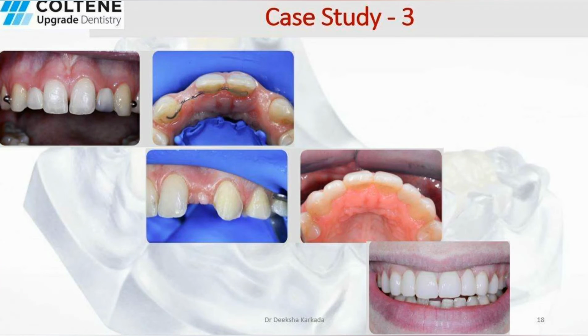This is another case where missing lateral incisors were replaced with an over-contoured partial denture. So minimal buccal preparations were performed for occlusal reasons, and all the front teeth were veneered with BRILLIANT Composite, and the dental arch was rounded. Treatment was performed without anesthesia and led to complete fixed and aesthetic rehabilitation.